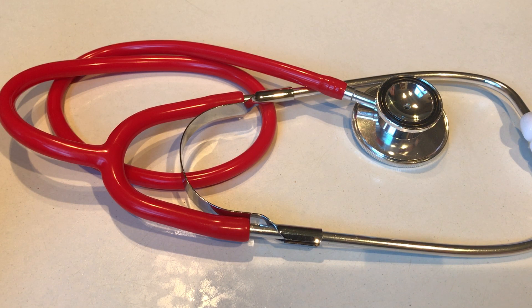So there you have it — the ValuMed Dual Head Stethoscope, available in a whole range of coloured tubes. Take your pick off the ValuMed website.